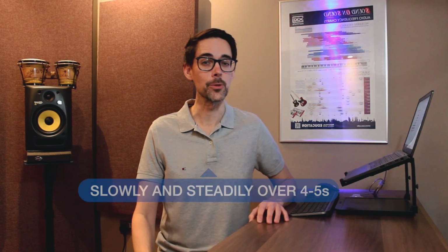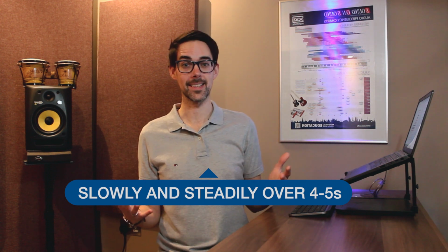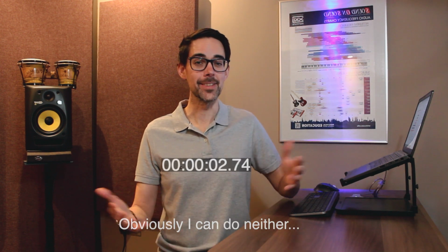So let's demonstrate. Now, if they say no, you can ask, are you able to breathe slowly and steadily over 4 to 5 seconds? And if the answer is yes, well, they can use a pressurized metered dose inhaler.